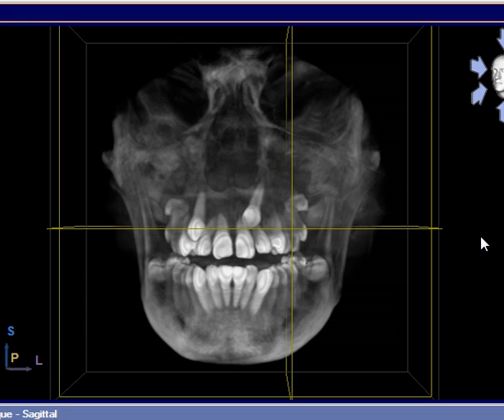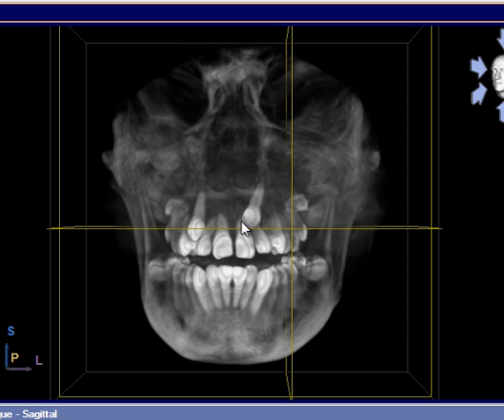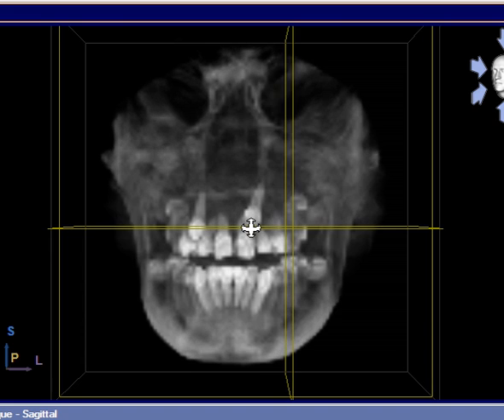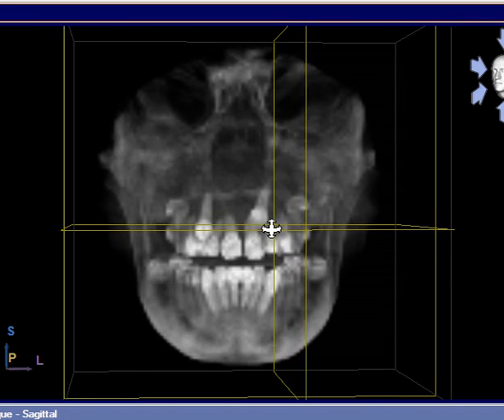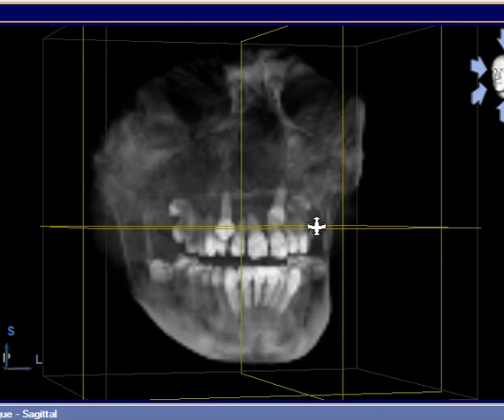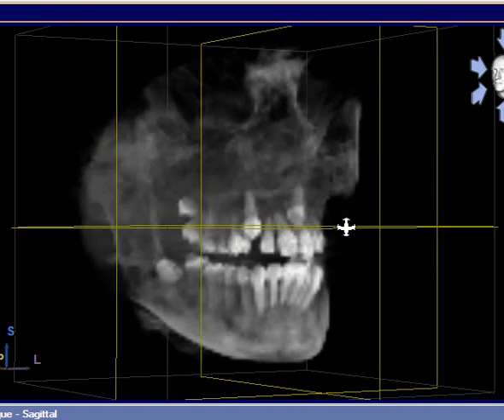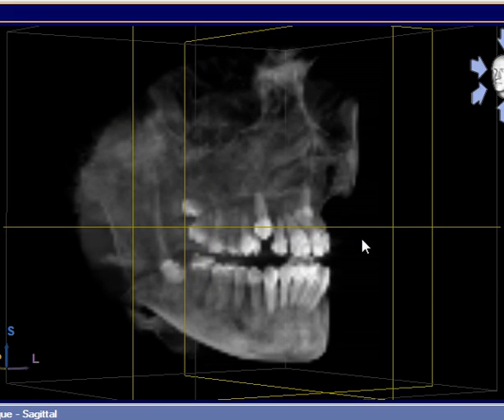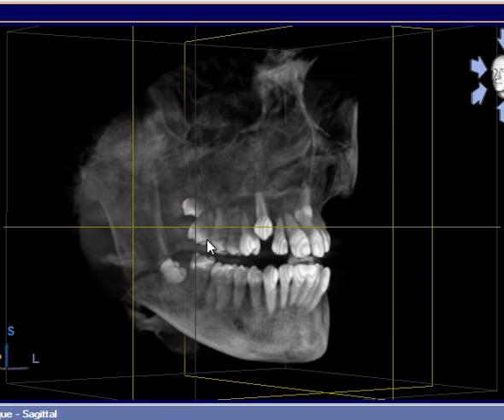Hi, this is Dr. Nuveen again. As you can see, pictured in this window is a three-dimensional representation of a patient's skull. I can rotate this image around. As I rotate the image, it does lose a little bit of its clarity, but then comes back after I stop.